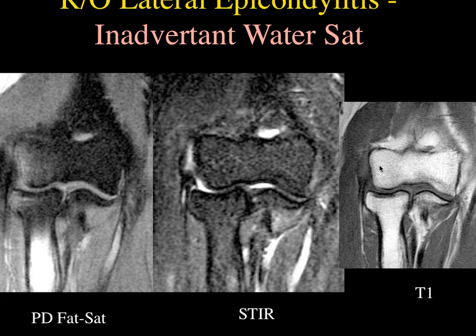And this is what the T1 weighted image looks like in that location. So whenever you see this kind of inhomogeneity on the fat sat image, you've got to be very concerned about it. You can see it due to the inhomogeneity of the field, or you can see it also if you have metal or other foreign body artifacts within the image.